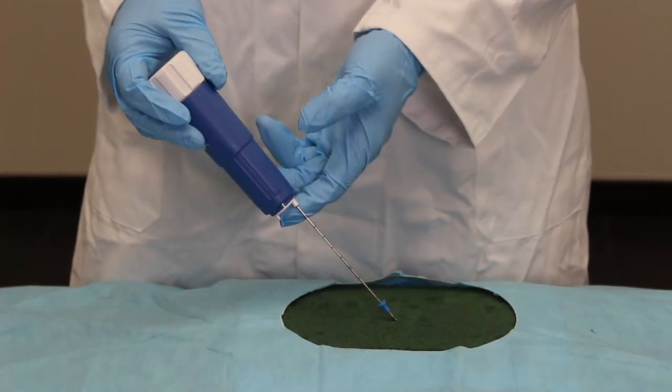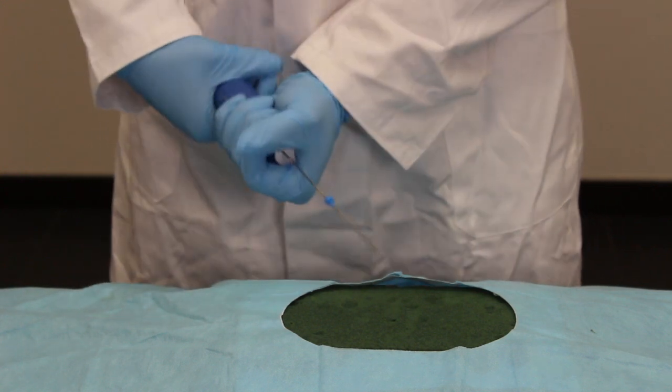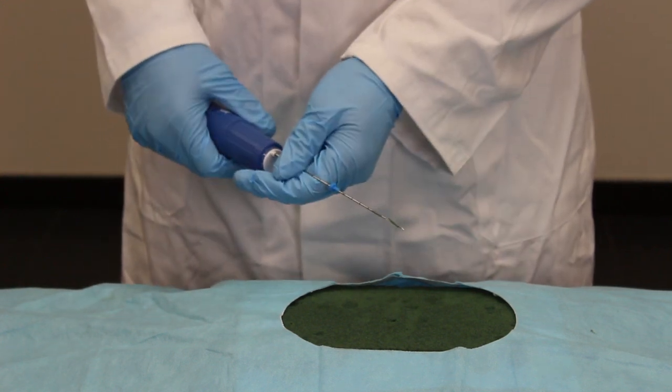Remove the needle from the patient and rotate the end of the instrument one half turn to withdraw the cannula and expose the biopsy specimen.